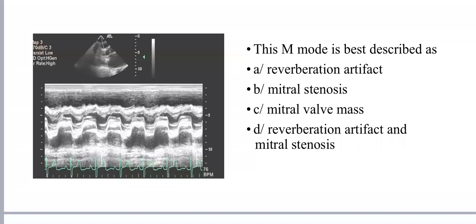I think D. D. Okay. Okay, Amina has chosen B. Any other? D? D. Okay. D. Great. So D is reverberation and mitral stenosis.